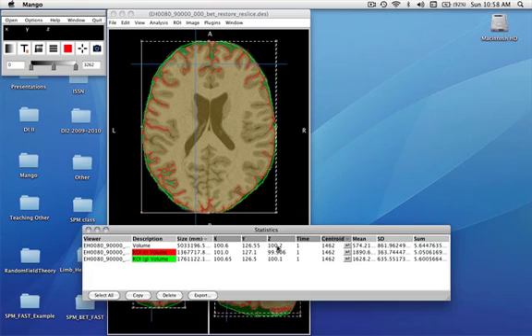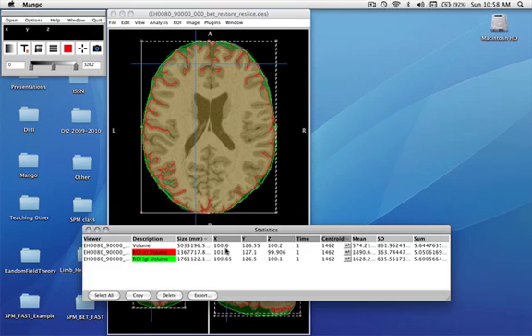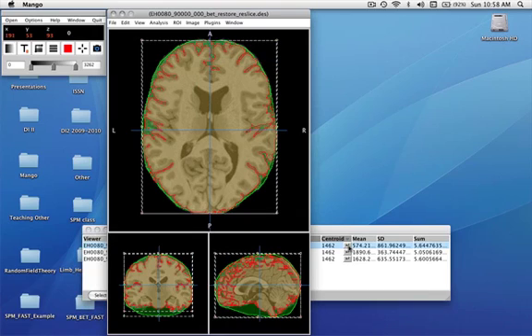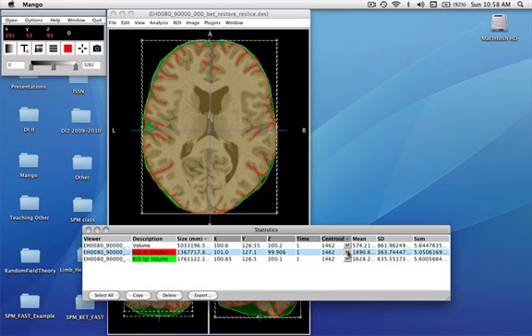Probably the most interesting thing to use here is the centroid, or the max. In the centroid, pretty much the same location. This is a weighted value location. Slightly different due to the fact that we have different portions of the image included in the weighting. But they're very close. In fact, if you click on it, the cursor goes to the location indicated here is the centroid.